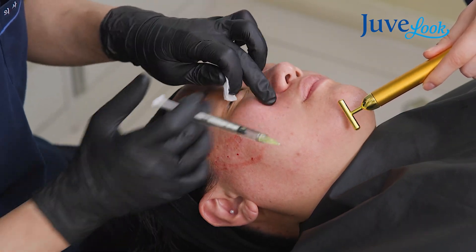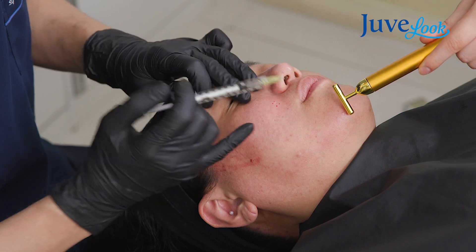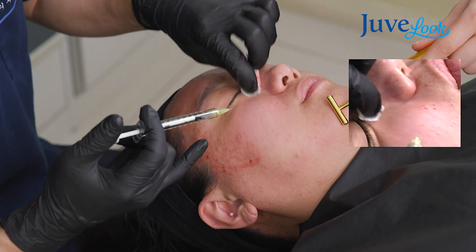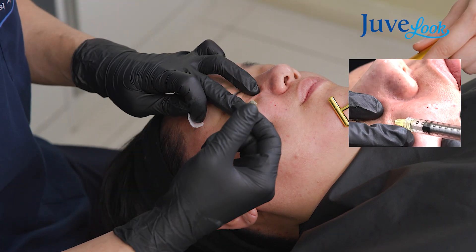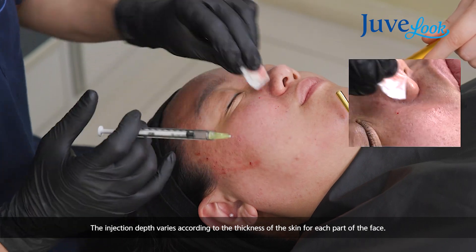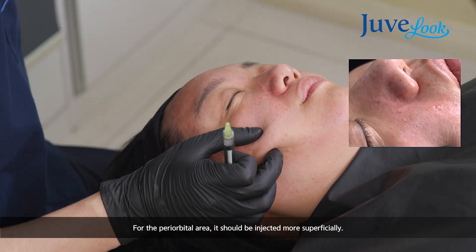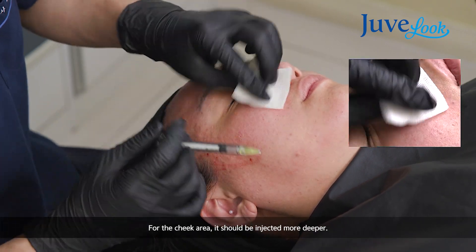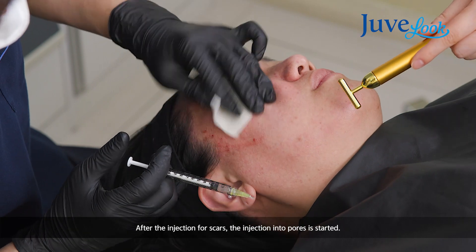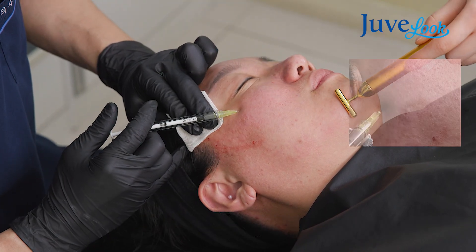You will see the scar is a little elevated compared to before injection. This part is more painful because it's the central area of the face. The injection depth should differ based on skin thickness — for example, the periorbital area you should inject more superficially, and the cheek area you can inject a little deeper. I think I've finished injecting into her skin scars, and now I move on to pore injection.